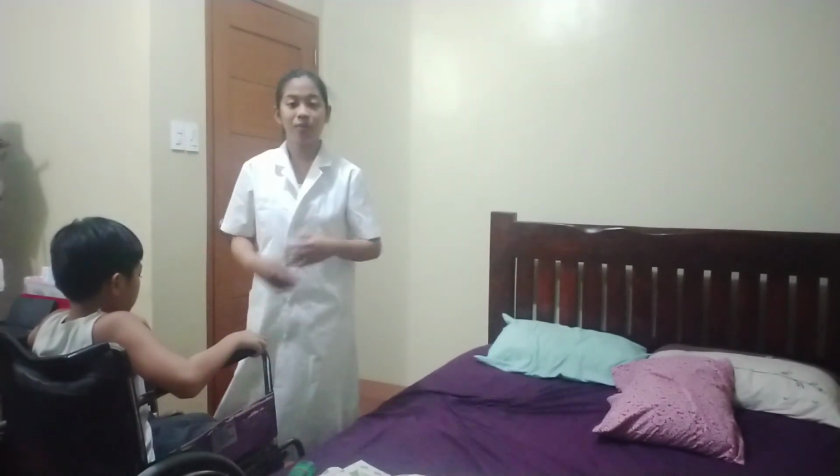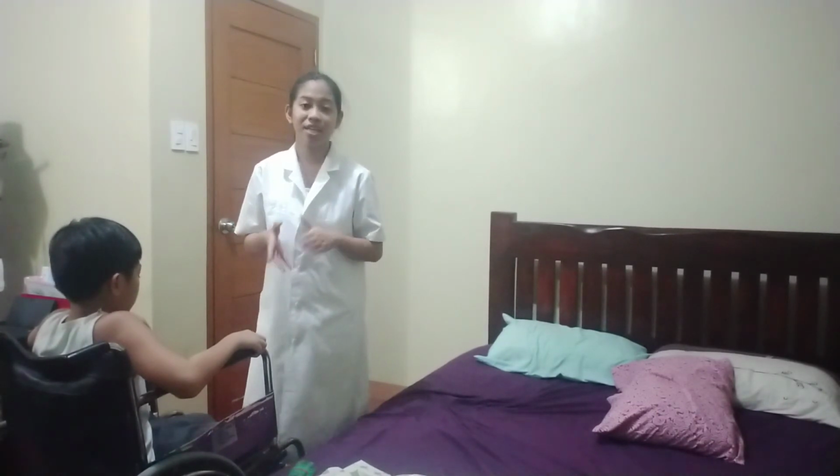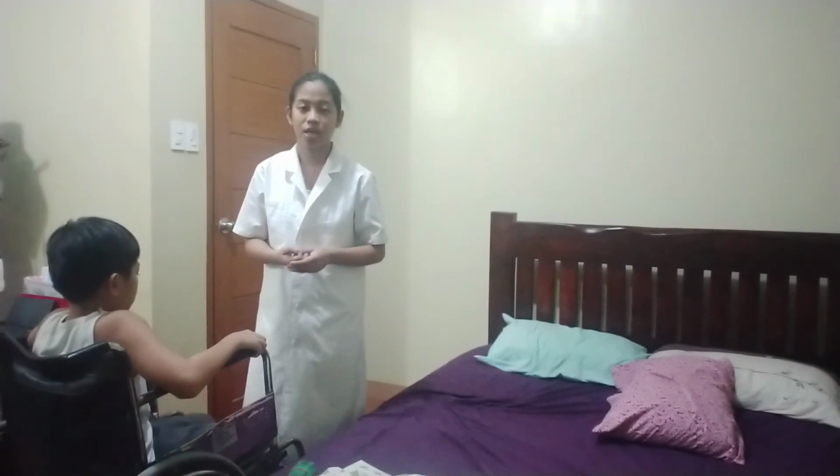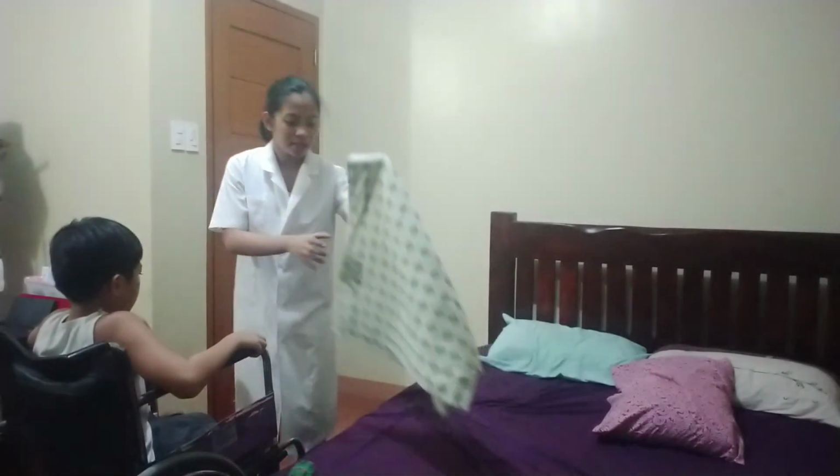And then, I can remove the gait belt or I can leave it in place to use for the return transfer, depending on the comfort of the patient. And then I will put on a blanket.